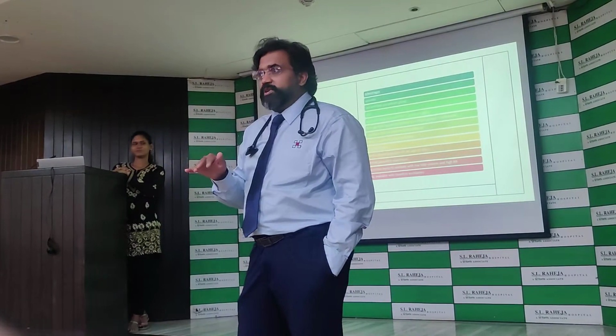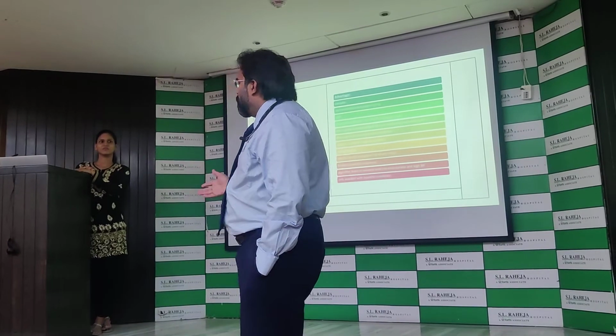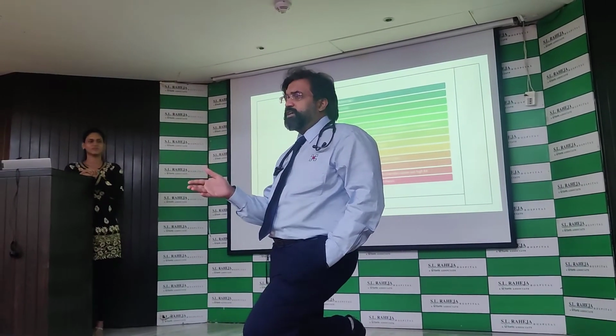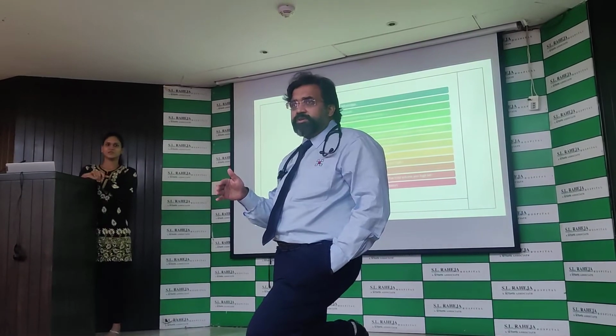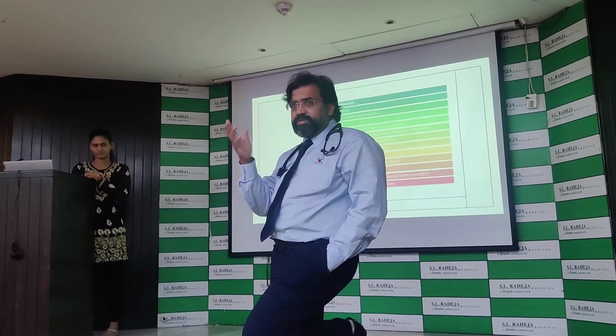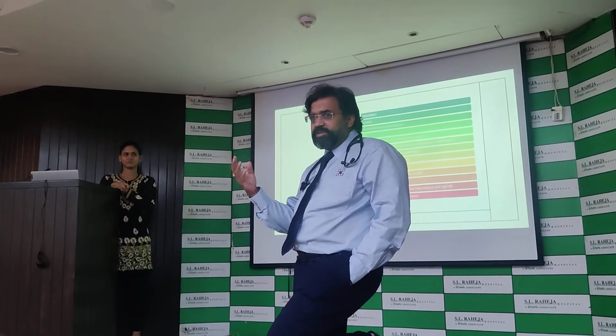So it is still comfortable. It is still okay. You treat the cause. The cause may have been that it has gone into a restrictive pattern, fluid has increased, something like that. So it's going into the fast RR to reduce the tidal volumes. It is tidal volume. Compliance is worsened. That is what occurred. Compliance worsened. The patient probably collapsed because he was on the ventilator. Compliance would have worsened. That's why he became fast.